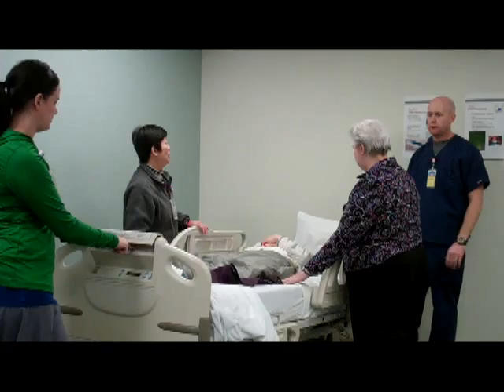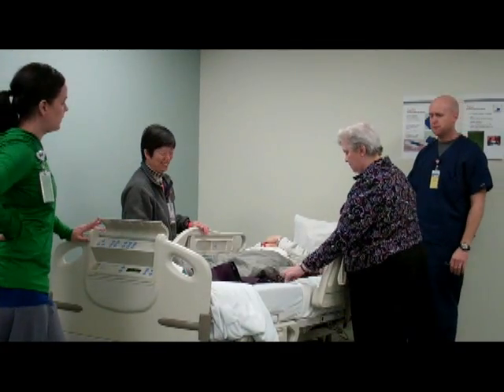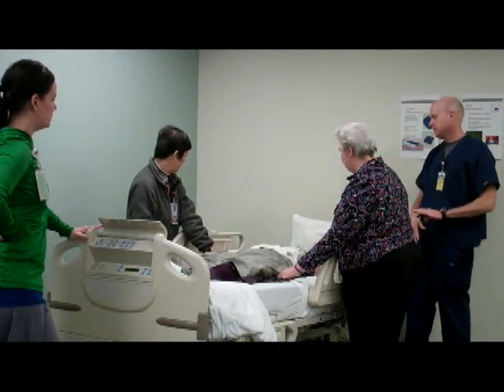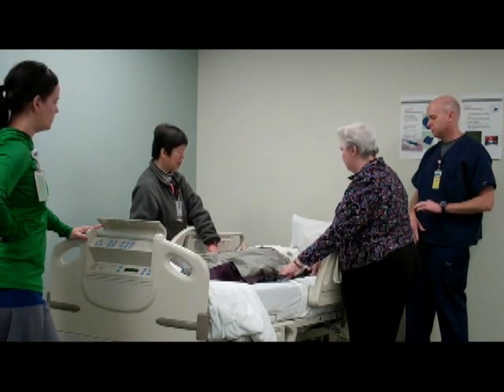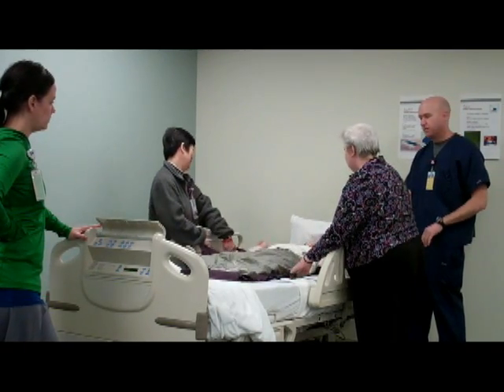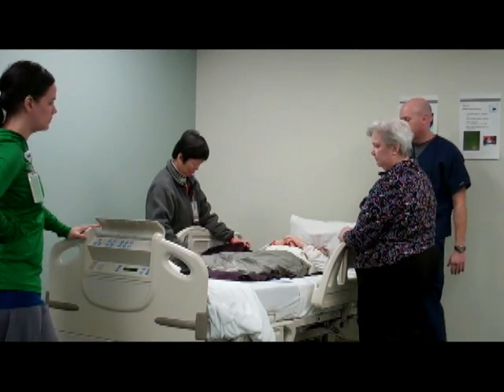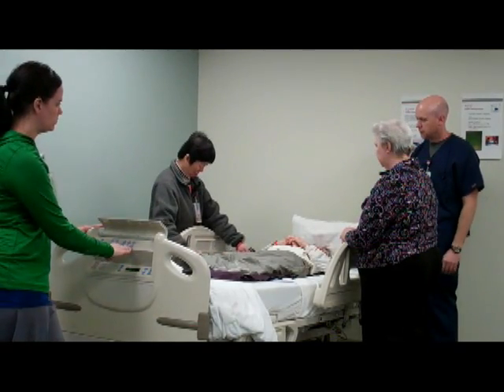So where do you take this? That you guys should have on your floor. Well, most floors have them. Some floors you'll have to order. Now she can just grab up on the side rails here if she wants. Just give yourself a little pull. You don't even need to help her if you don't want to. It's so easy. It reduces the friction so much she can practically do it herself.